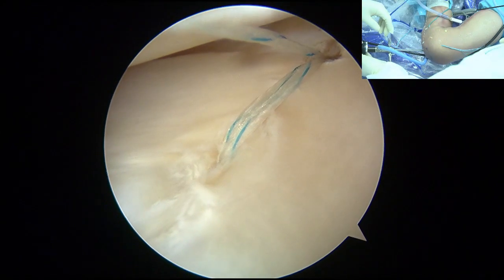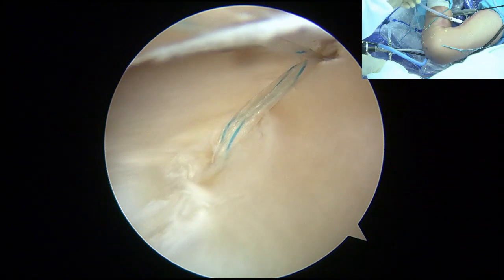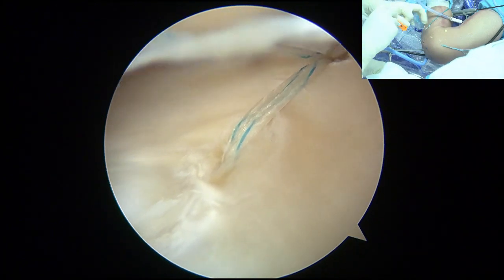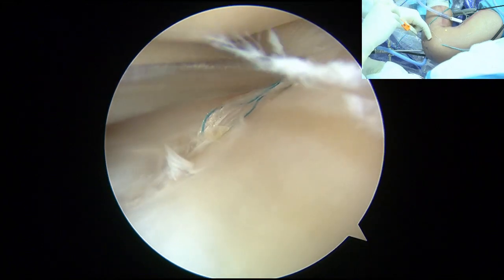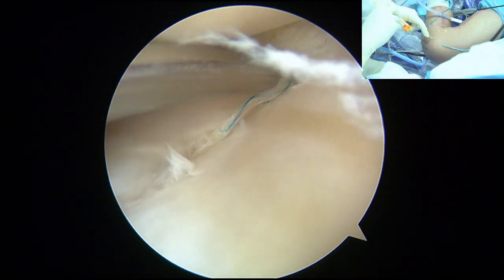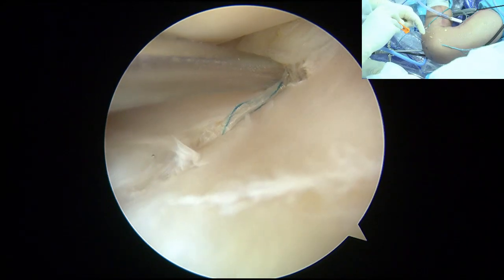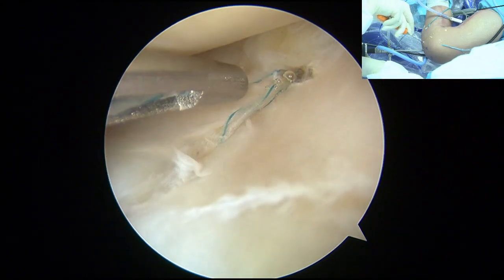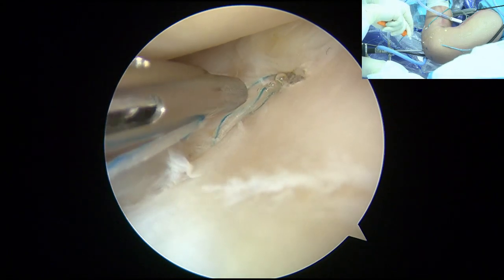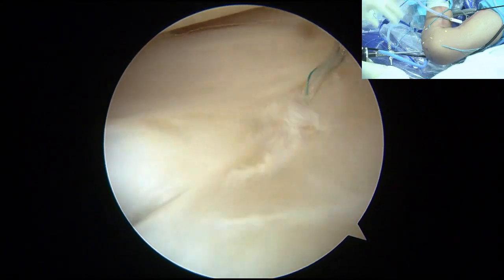That way. If you want to go this way, you come from the opposite side, right? 然后操作呢，要利用对角线原理。And tension this way. Slowly go. Slowly, okay? Slowly push. That way, okay? Until you are satisfied with the tension. Then I leave a little bit. Not too close, okay? Leave it like that, okay? Good.